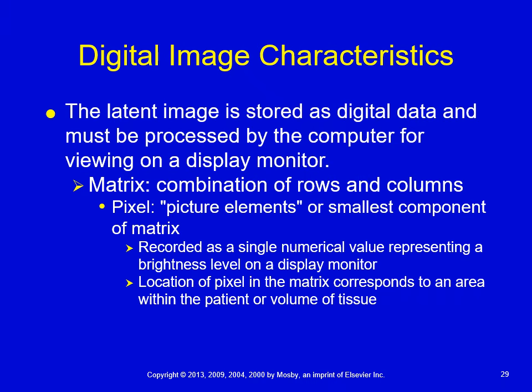When you're buying a camera or your newest phone, some of us are interested in the MP of the camera, or the megapixels, because the more pixels or megapixels the camera has, the better quality those pictures are. The same thing happens in X-ray. We're talking about digital images as well, but we're just talking about X-rays.